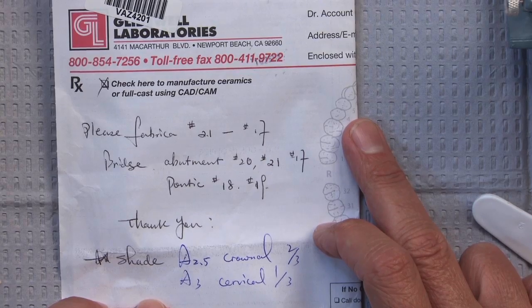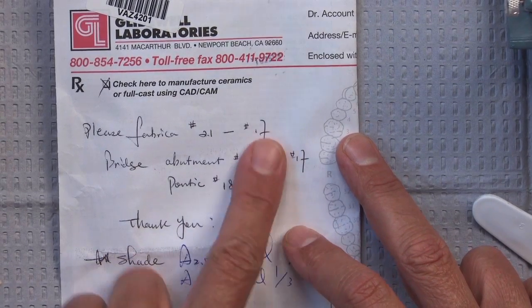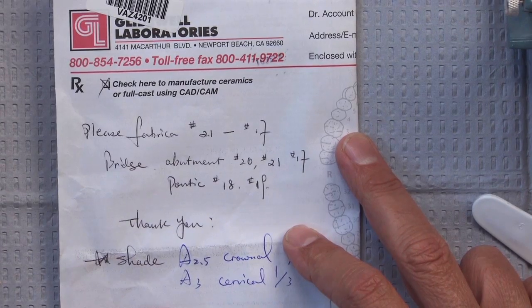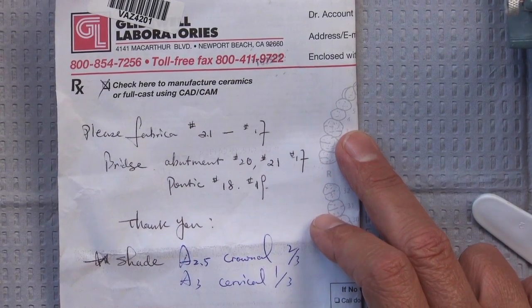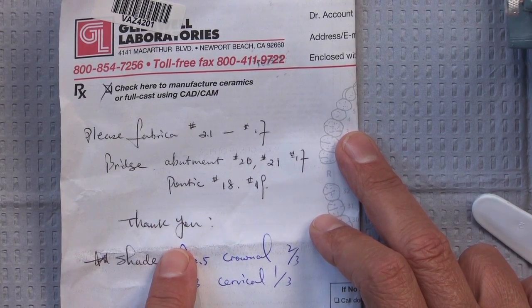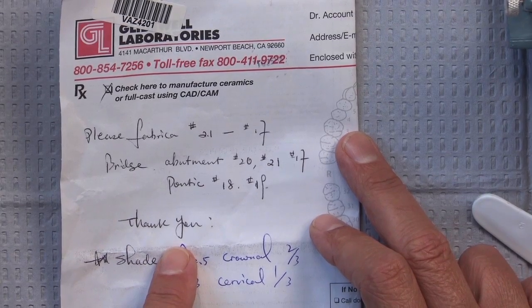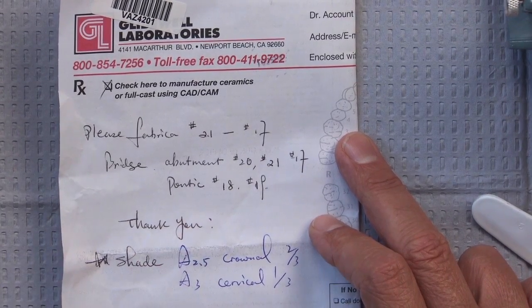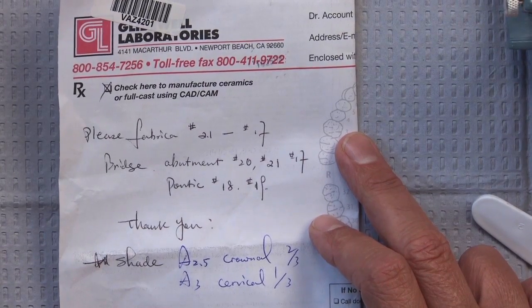On this week's Case of the Week, we've got a doctor who has requested a bridge from number 17 to 21 with 3 abutments, 17, 20, and 21, and 2 Pontics, 18 and 19. And you'll notice there's no product mentioned here, and so that defaults to a PFM bridge the way our lab slips work. So if a doctor were just to write down crown number 3 and write nothing else, it's just kind of assumed that they want a PFM.